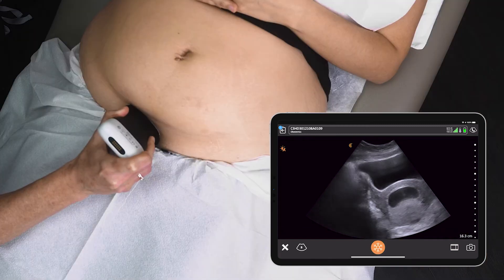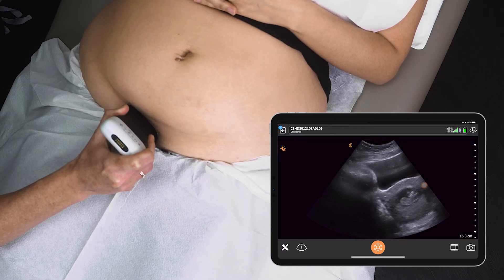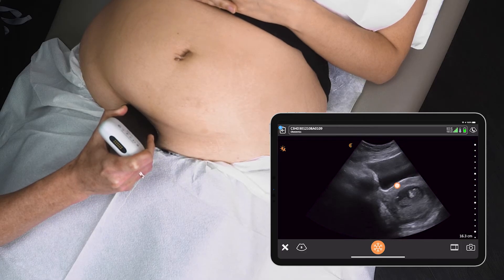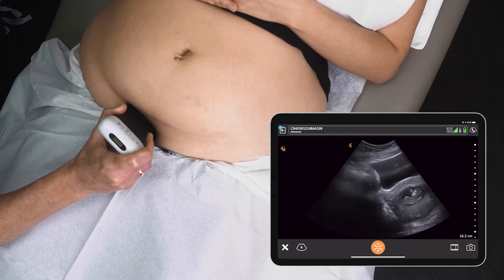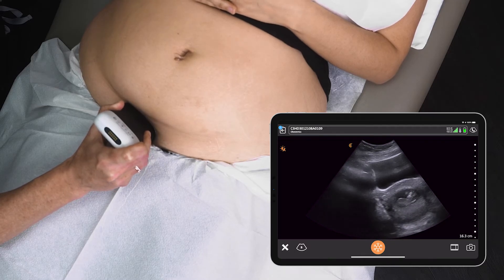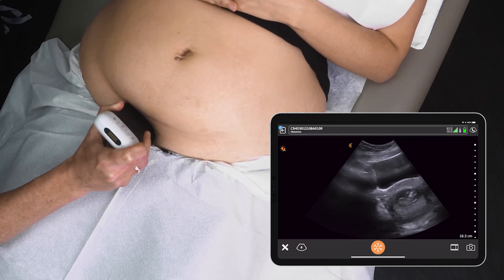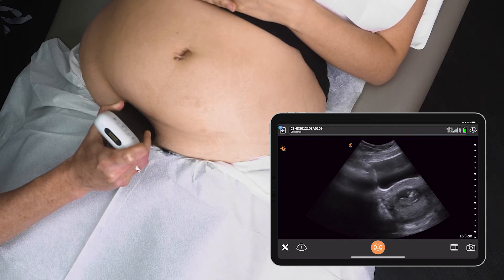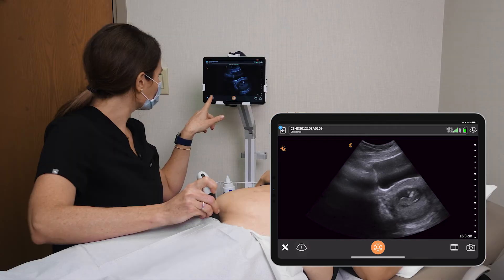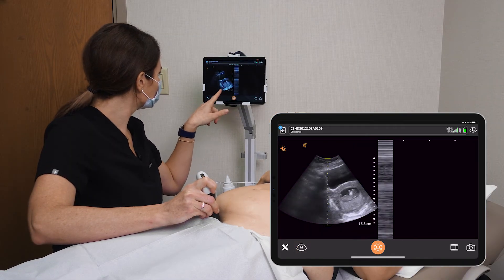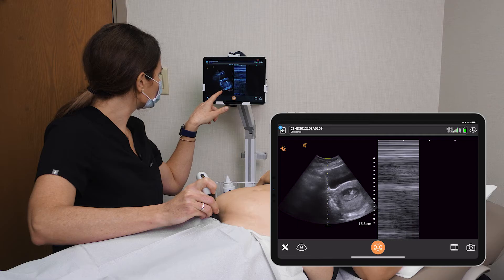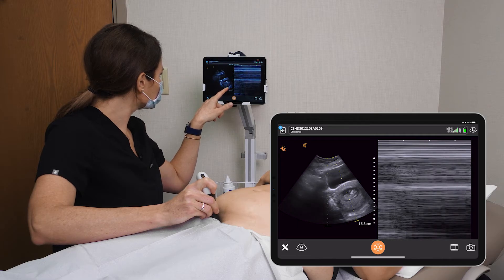We're going to keep scanning. There's a nice little profile view — let's take a picture of that. Great. So we can see the heart beating there, Lisa — looks good. I'm going to measure the heartbeat; I'm just switching to M-mode and I want to move my caliper over to the heart.